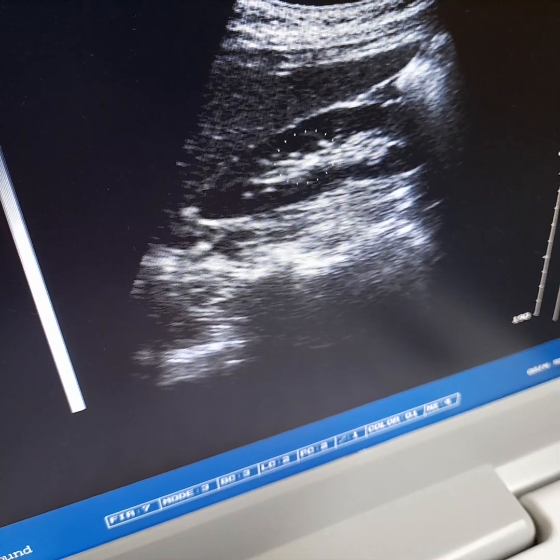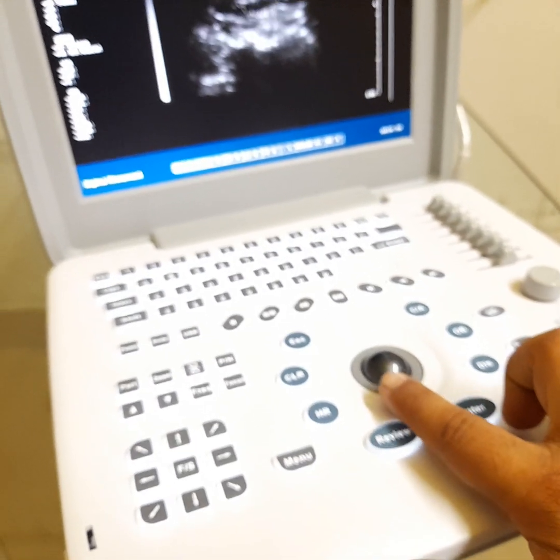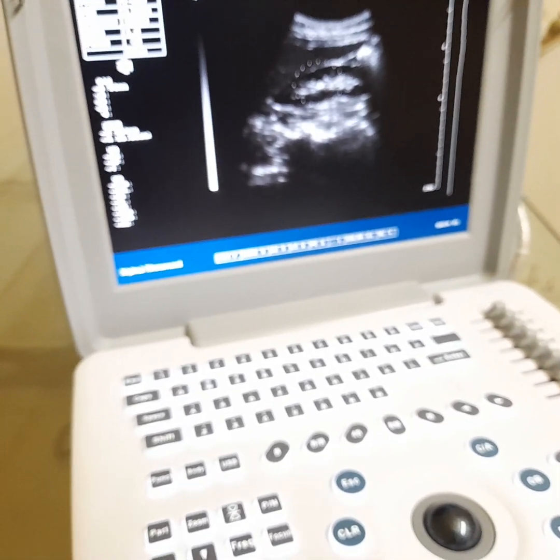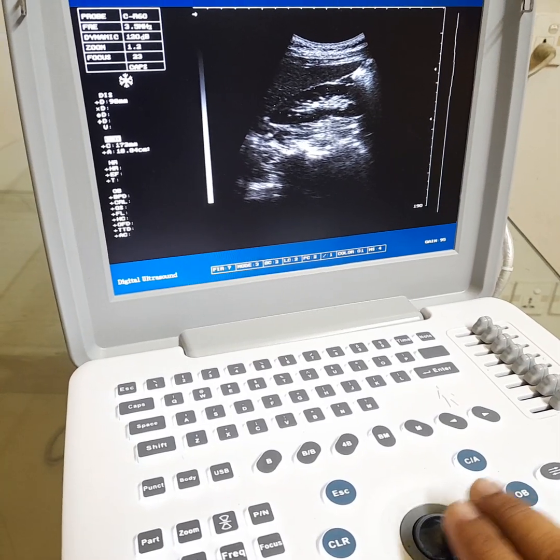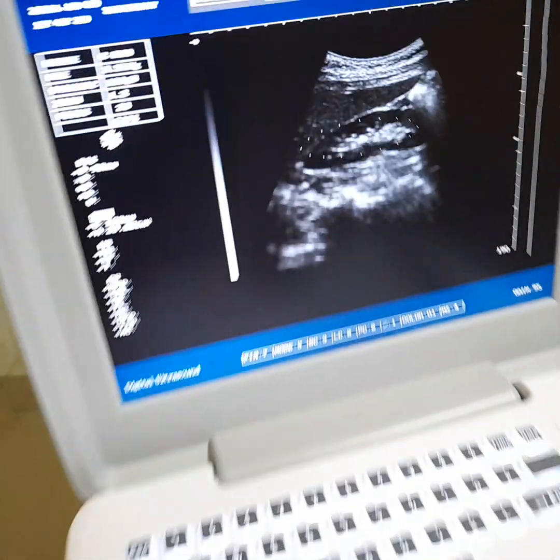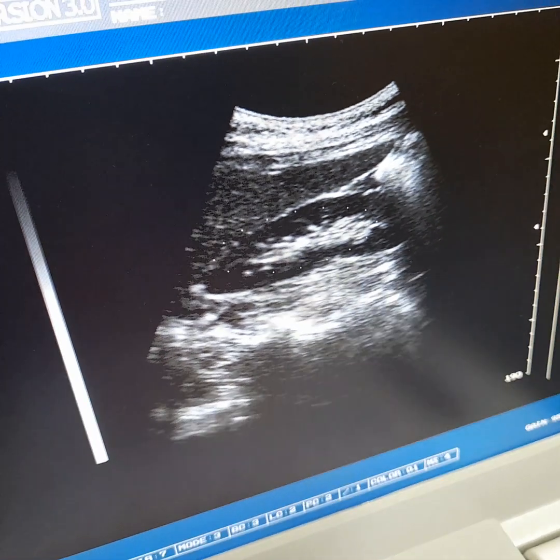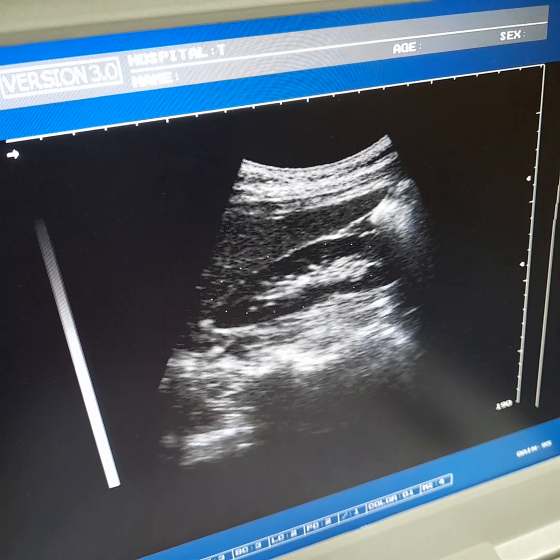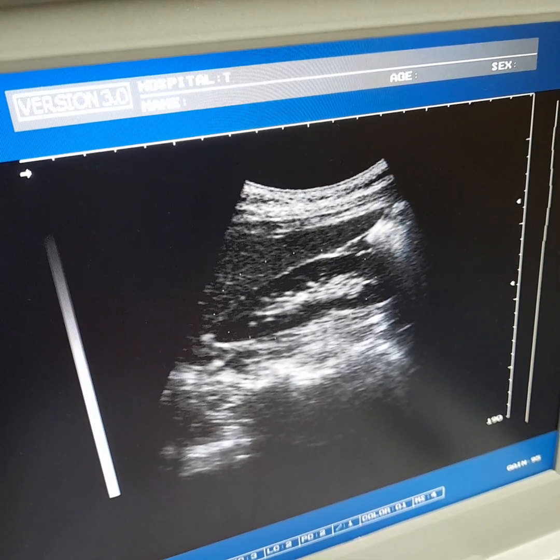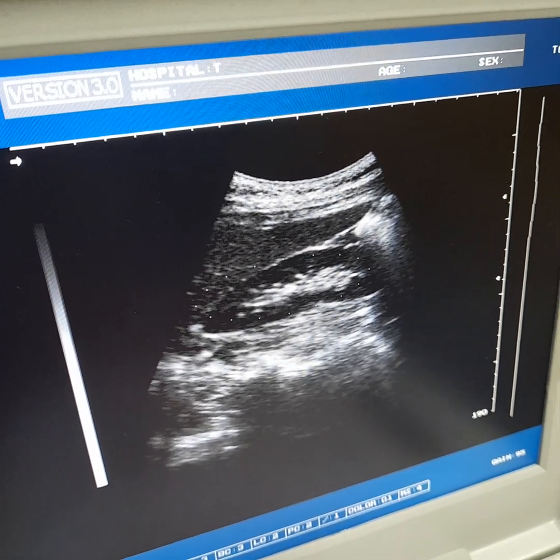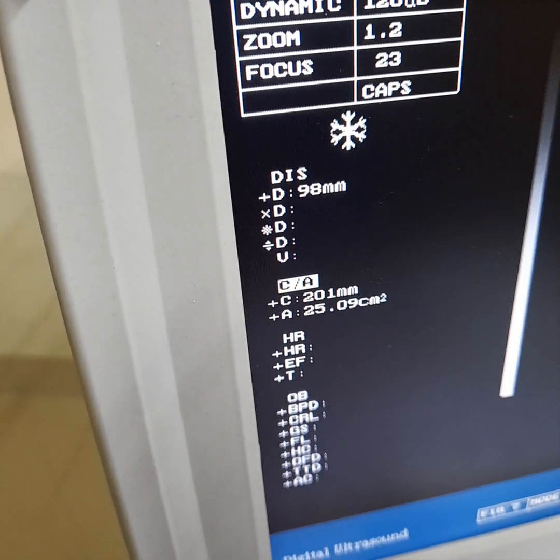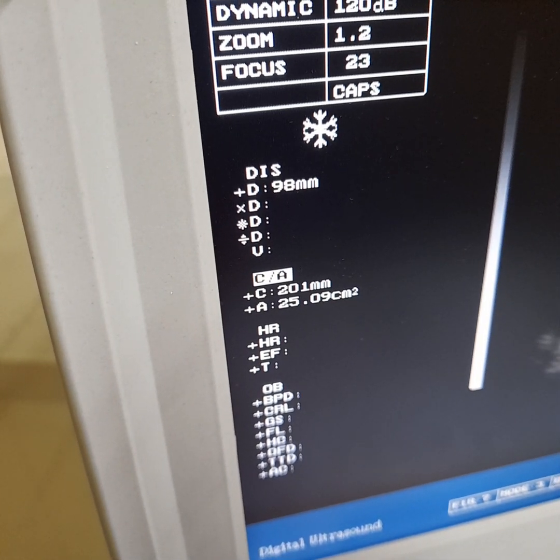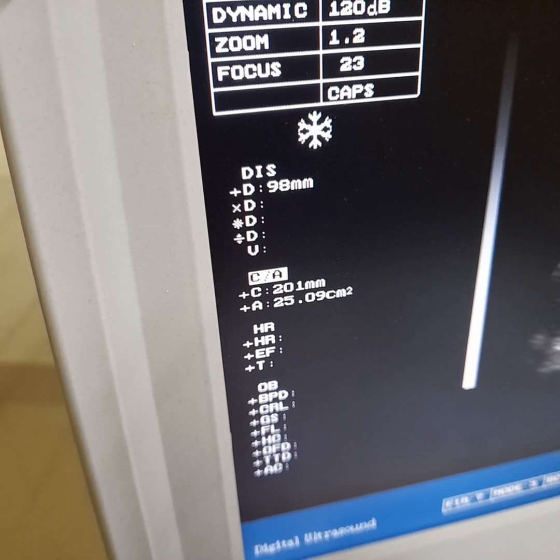Now move the trackball outward to expand the circle. Fix the circle around the kidney, then press Enter. The measurement result is 201mm and 25.9 square centimeters.